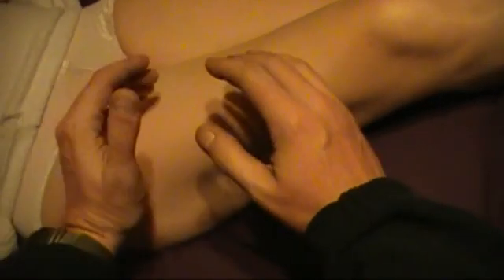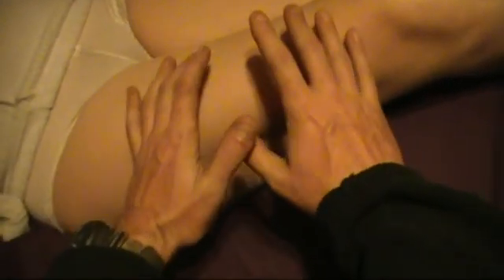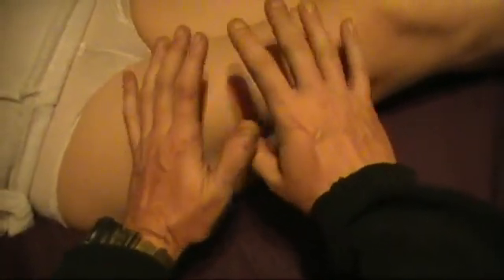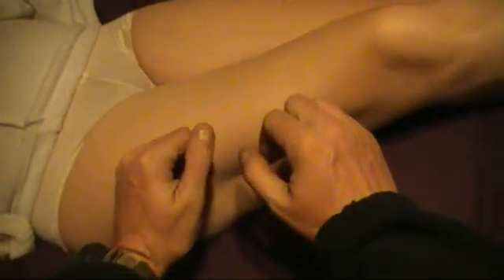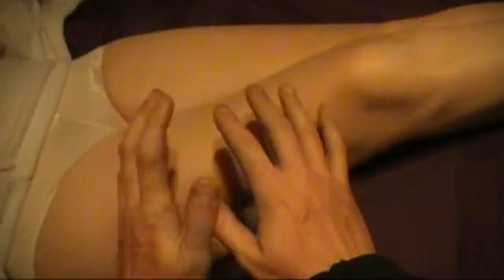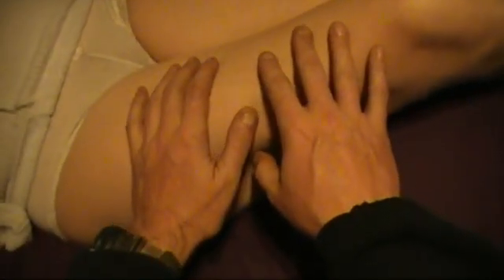Now, tourniquets are used for one purpose and one purpose only, and that is to stop uncontrollable arterial bleeding. If you don't know what arterial bleeding looks like, the first time you see it, you will go, in your mind or out loud, holy fuck. It's not like any cut you've ever gotten before. At this distance, if it was a femoral artery bleed, I would be getting sprayed in the face. It's an obscene amount of blood, an obscene amount of pressure.